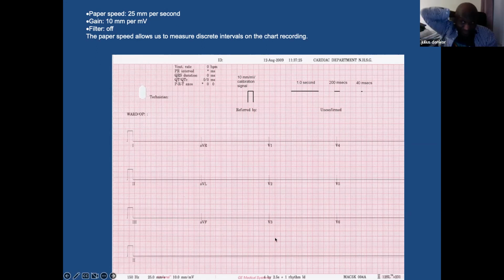Elvis, we're speaking about, and AJ will support me on this, when you look at your standard EP EGMs, they normally speed them up to about 100 millimeters per second. So that means it has to slow down so that you can actually see it.